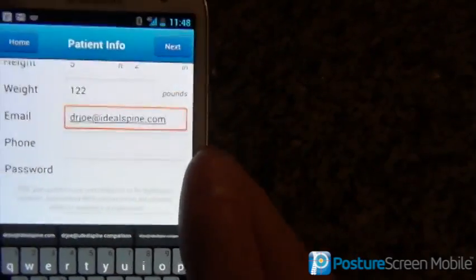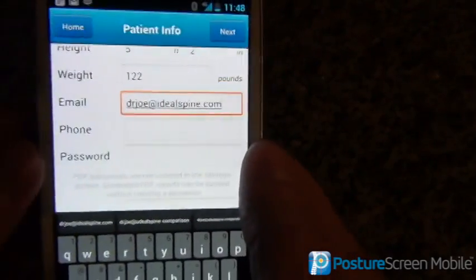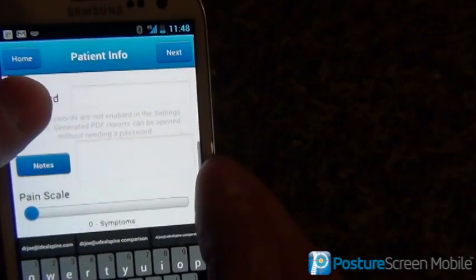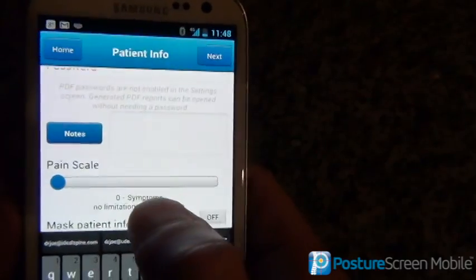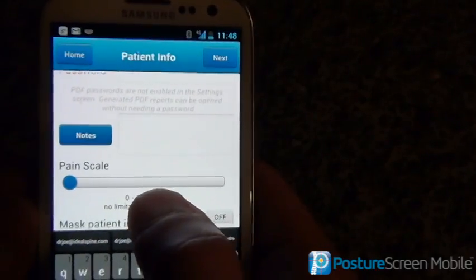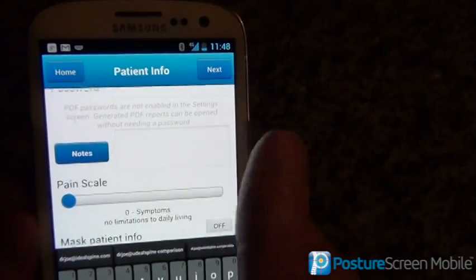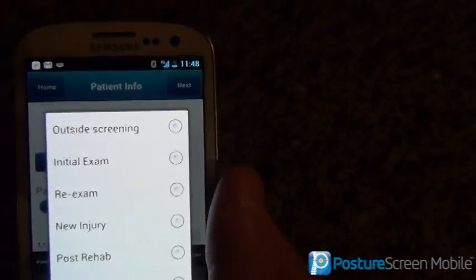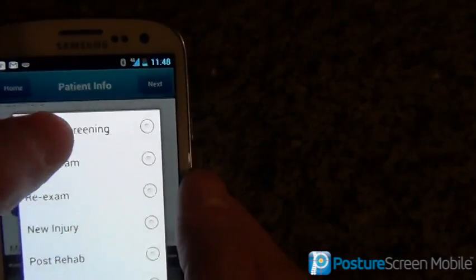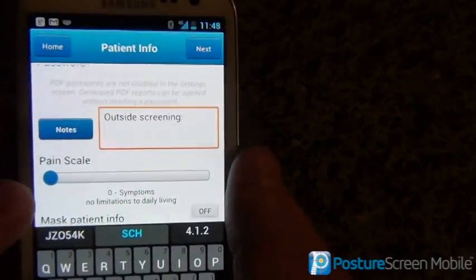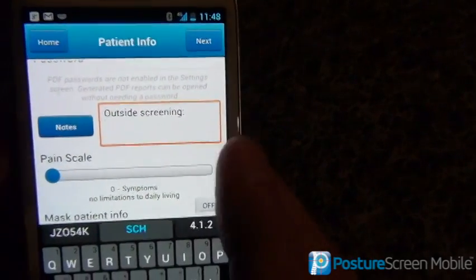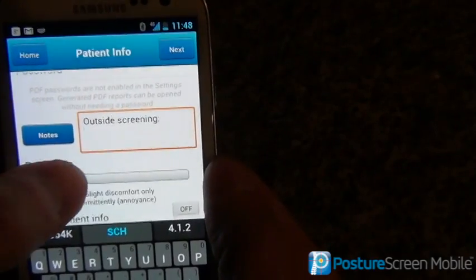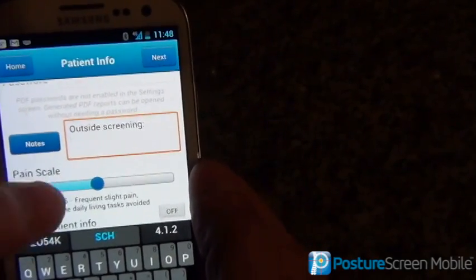If you're a fitness professional, HIPAA doesn't apply, so you can skip that. In the notes section, you can say where the screening was done — was it at a gym or wherever you want. We have predefined options; we can say this was an outside screening. Next, we can do the verbal rating score or pain scale. We're going to put them at 5 out of 10.